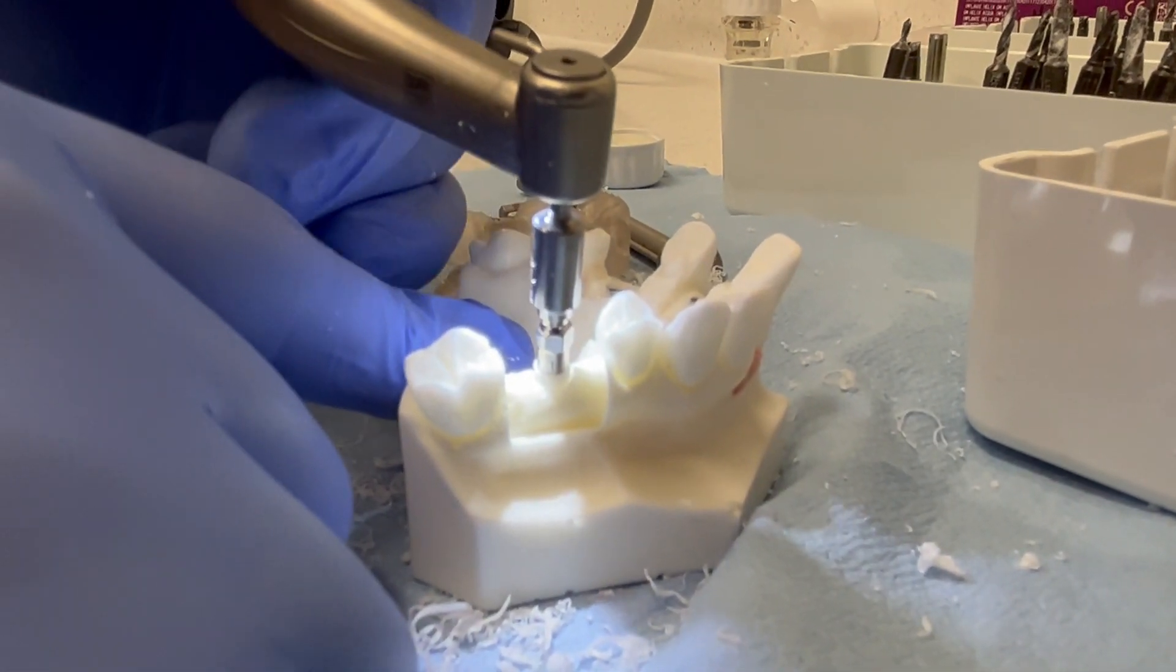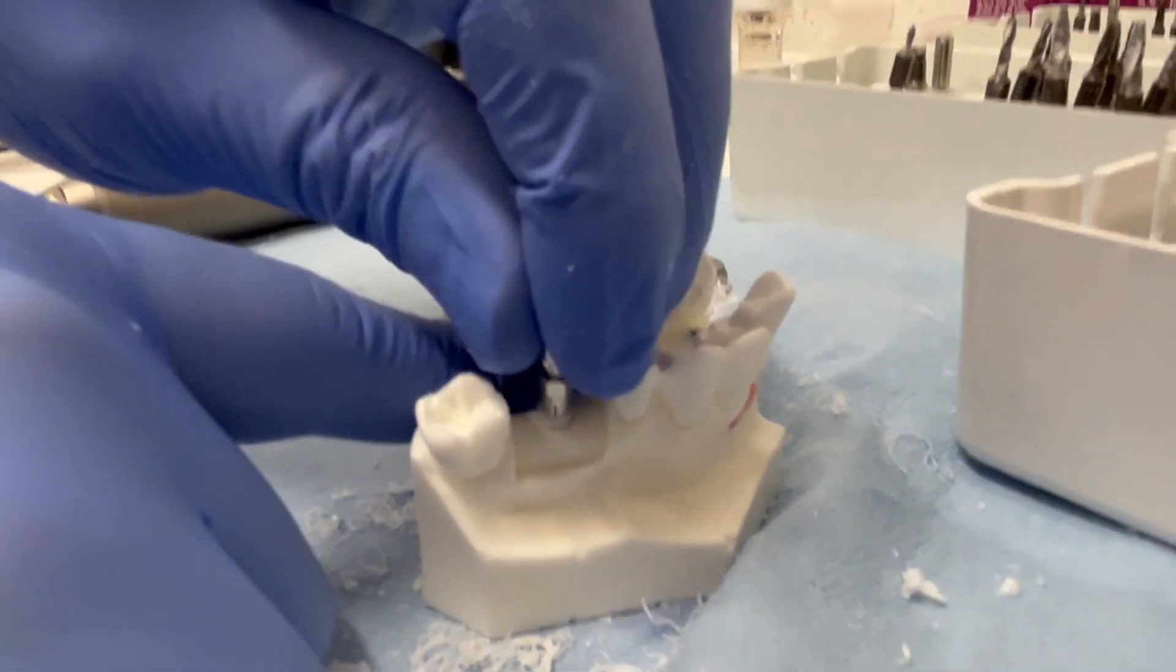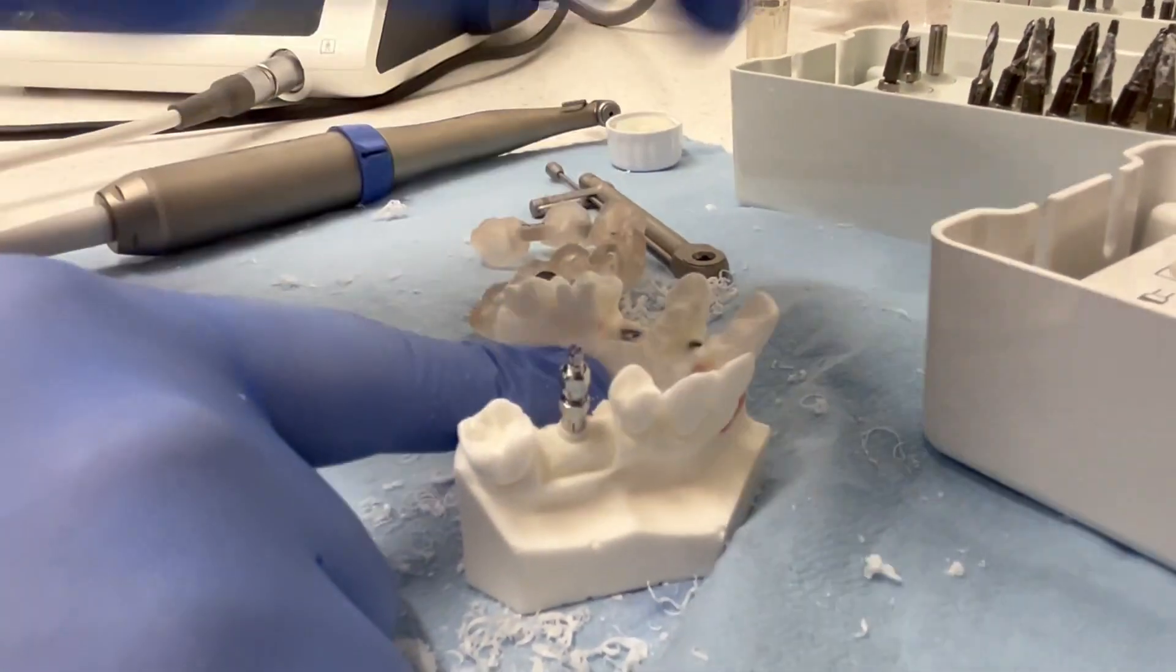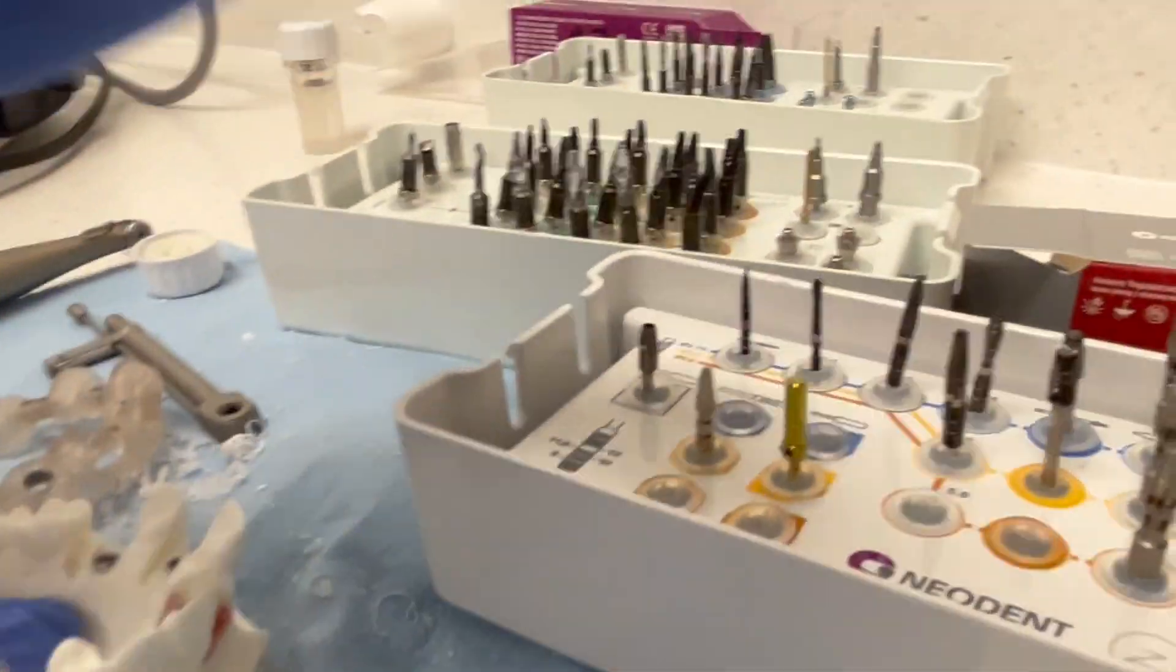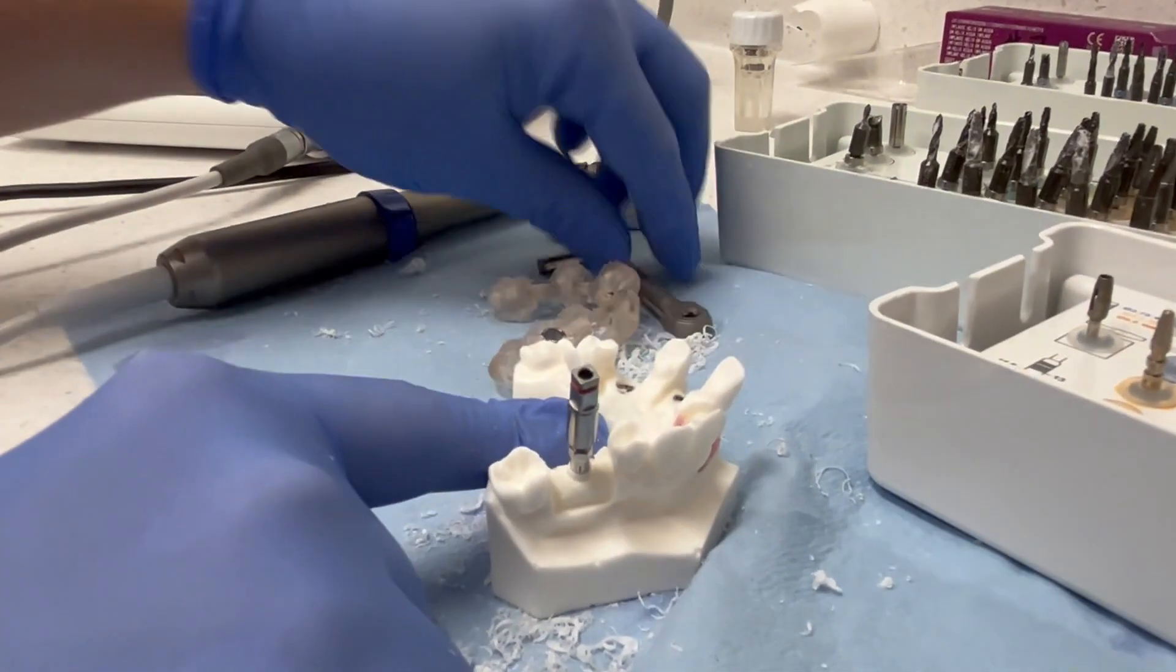So there you can see we're already at 35 newtons. We have about a millimeter and a half, two millimeters to go. So at this point, I'm going to keep this mount on. I'm going to change to our ratchet driver until it's fully engaged.